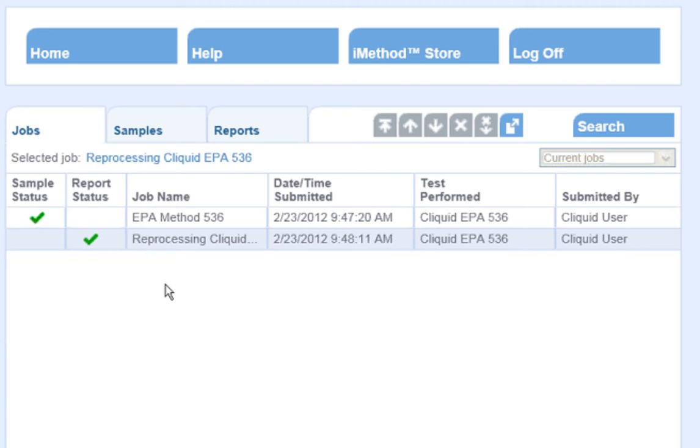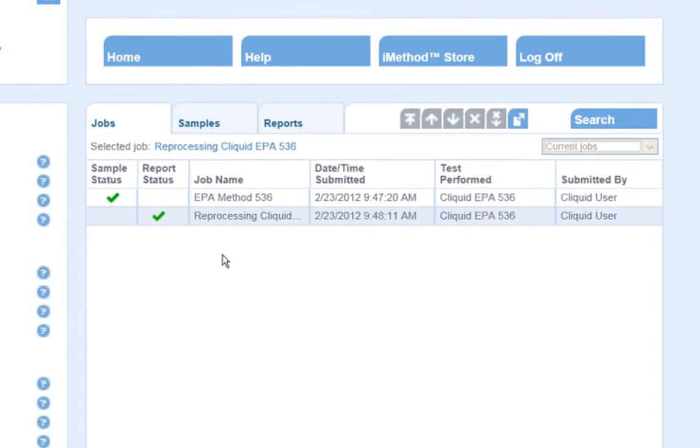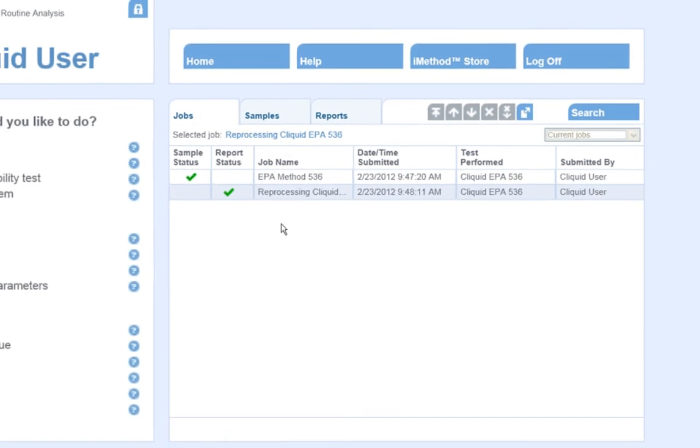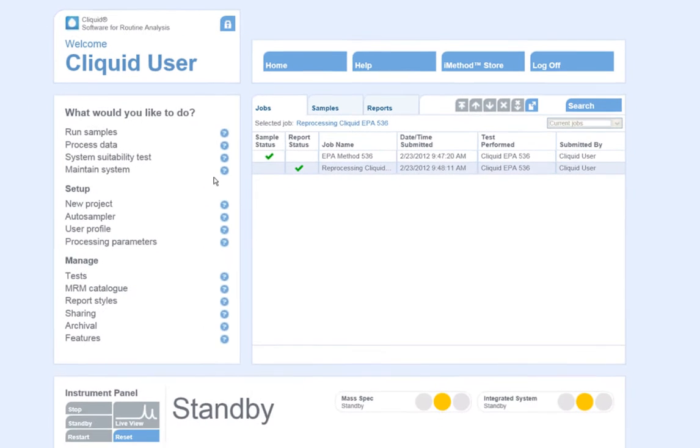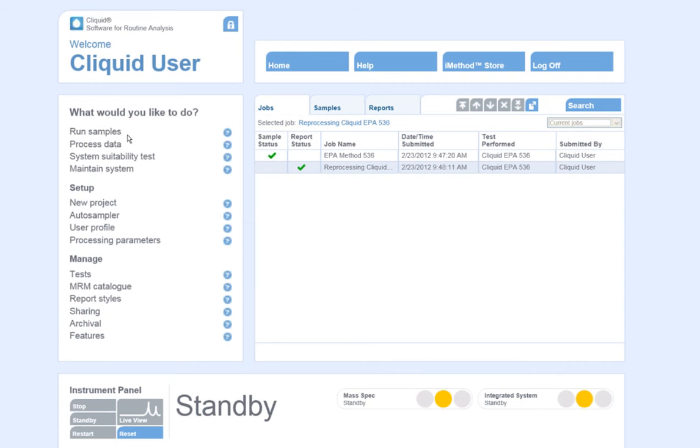A common daily task is for a user to submit a sample batch. To run samples, simply click Run Samples under the Task menu.